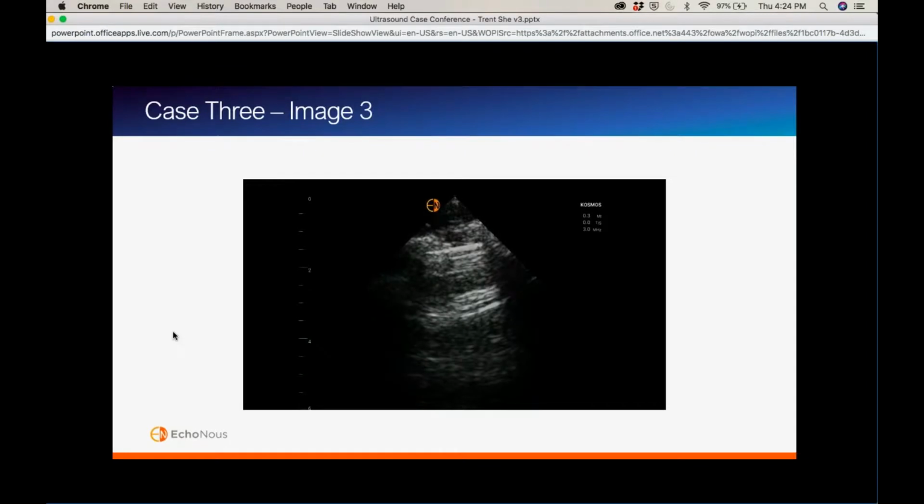And so we listened to the patient's lungs, and he actually had bilateral breath sounds. We didn't see very much lung sliding at all on either side of the apex, right or left. And so we were thinking, okay, this is weird. He has bilateral pneumothoraces, but he has pretty good breath sounds that we hear. And we didn't want to particularly go and perform bilateral chest tubes on this patient. So we ended up getting an X-ray, and they had good lung findings throughout. And we ended up saying that there actually wasn't a pneumothorax.